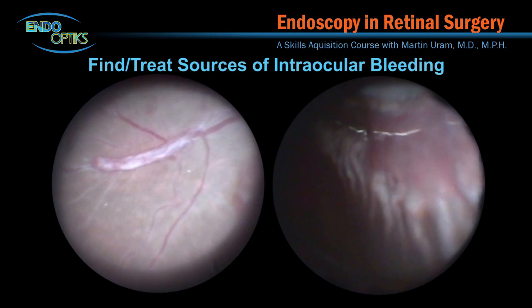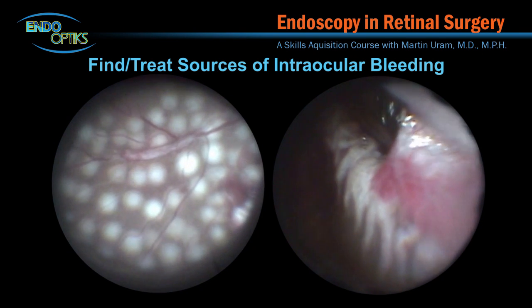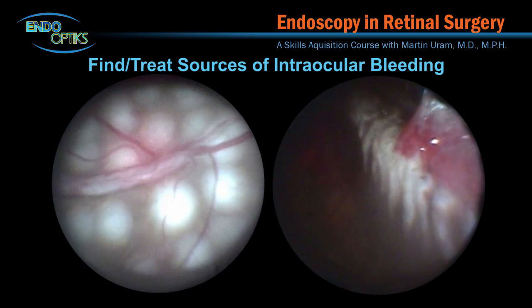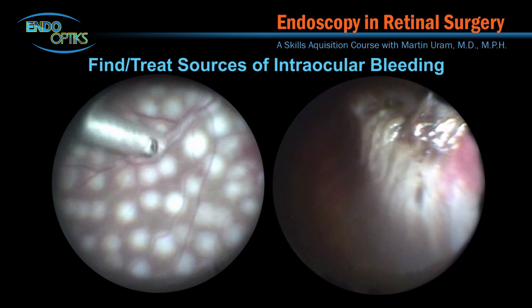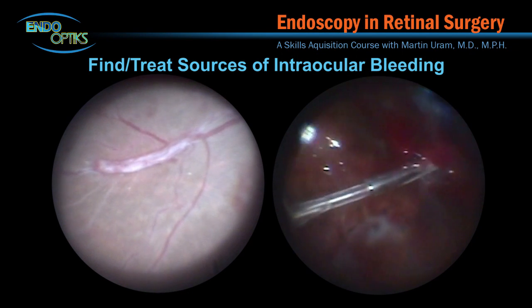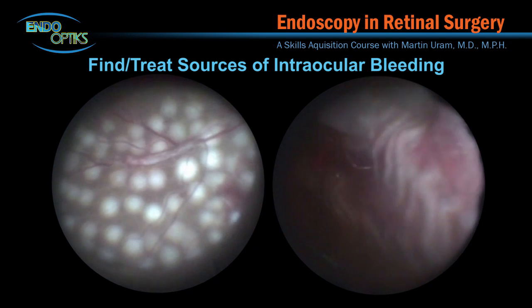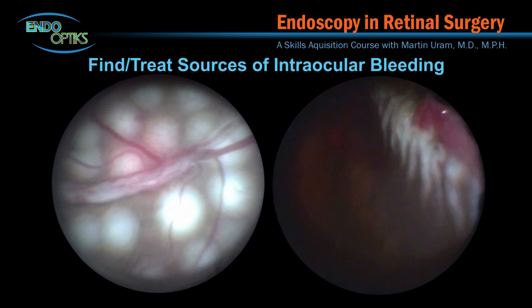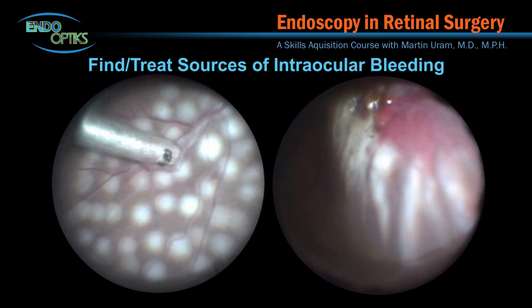Endoscopy facilitates the localization of a bleeding source. Some are straightforward, as in the video to the left, showing an area of NVE secondary to a branch retinal vein occlusion. Once identified, laser may be applied. On the other hand, sometimes the source of the hemorrhage is elusive. In the video to the right, a diabetic patient who has had multiple vitrectomies for recurrent vitreous hemorrhage presented with yet another recurrence. Endoscopic evaluation revealed a fibrovascular membrane extending from the ciliary processes along the underside of the iris to the pupillary margin. Endoscopic laser treatment was applied, and the patient has not experienced further bleeding.